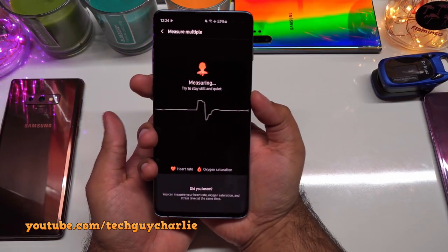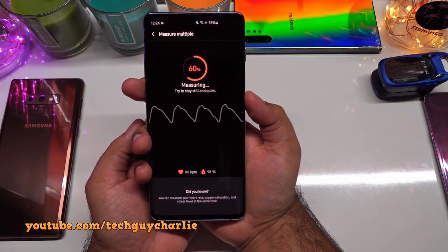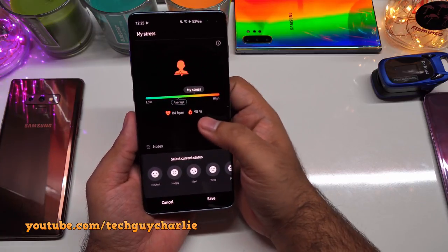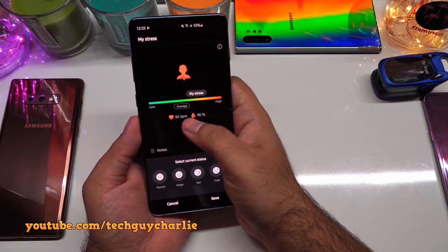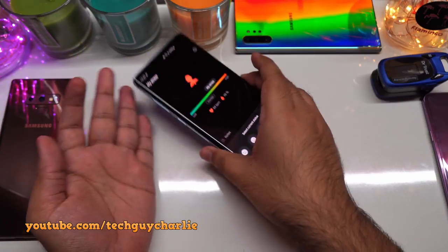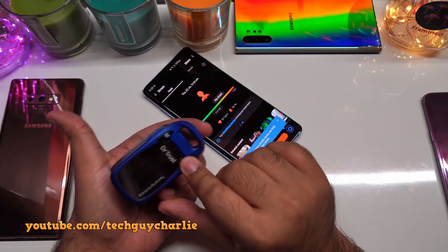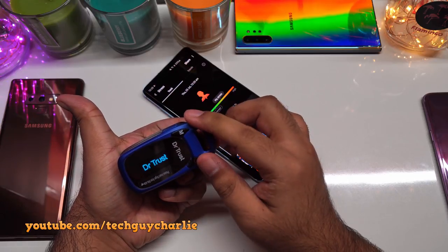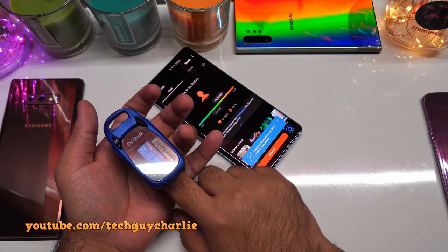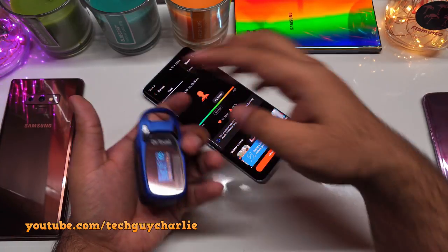You put your finger on the sensor and sit still and quiet. My oxygen saturation level is showing 98%, which is perfect, and my pulse rate is 84. Now comparing with a dedicated pulse oximeter on the same finger — it is showing 98% and pulse 85. So about the same.